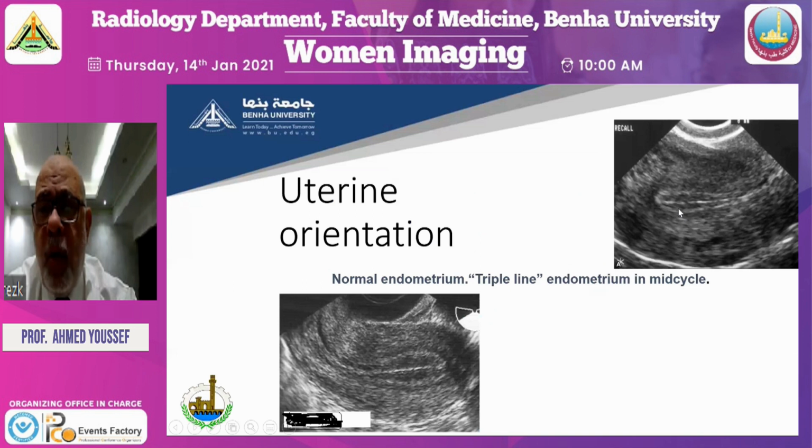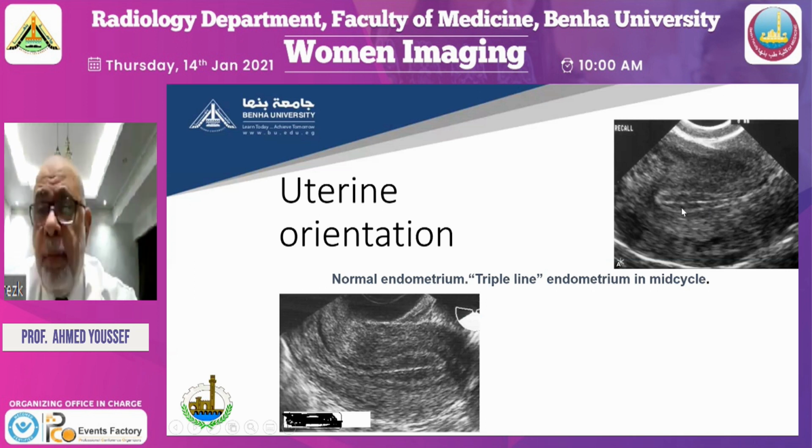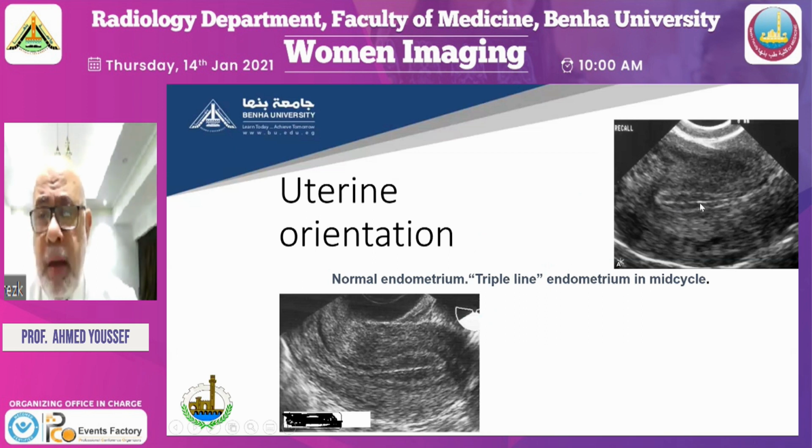We are depending on the endometrial pattern, this nice triple line. But if I find there is increased hyperechogenicity of the basal layer of this line, I may order progesterone to check for premature elevation of the progesterone. Because if it is above 2 nanogram per ml, I will not transfer the embryos this month.